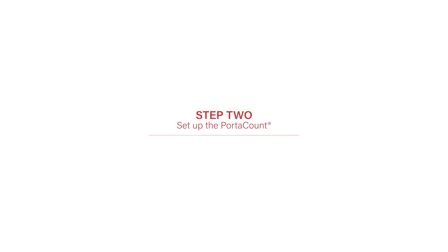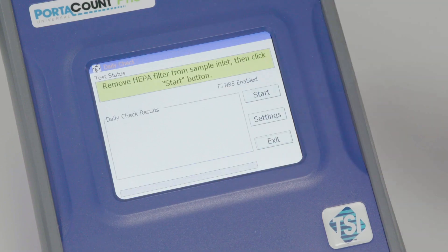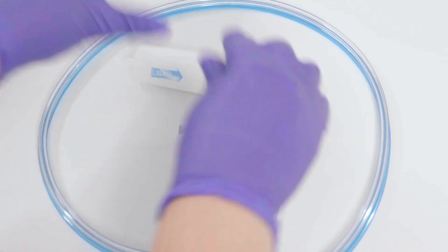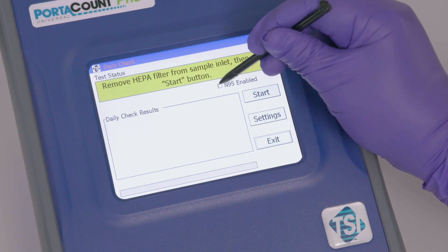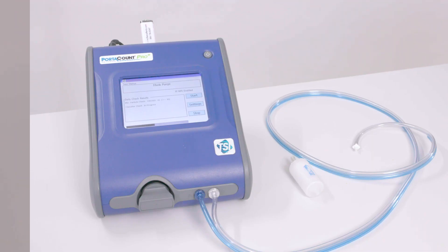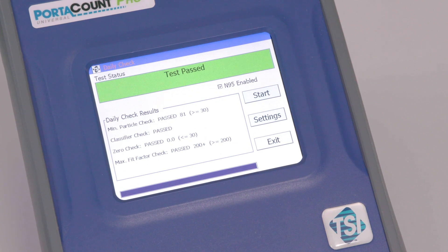Step two: set up the PortaCount. Be sure to conduct all daily checks and regular maintenance on your equipment to ensure the machine is working properly. These checks will provide confidence in the test results measured. Once you have conducted your daily checks and have confidence there are no leaks in the testing equipment, you may begin testing.